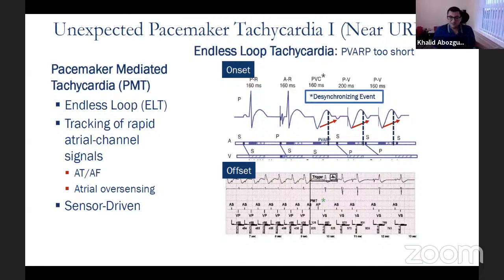So I will just start with making comments about the first question about upgrading to an ICD. I think if that is the case, I agree with Yusuf, there are so many factors involved. I wouldn't, as a standard, just extract the lead. I'll take so many things into consideration. The one thing I would suggest is if you have a pacing lead and you're planning to put an ICD lead, just ensure that you try to avoid putting it in the same place to avoid interactions, specifically the tip, if you can. But I wouldn't necessarily extract every lead.